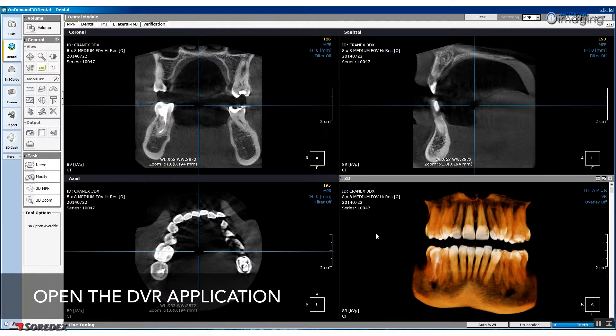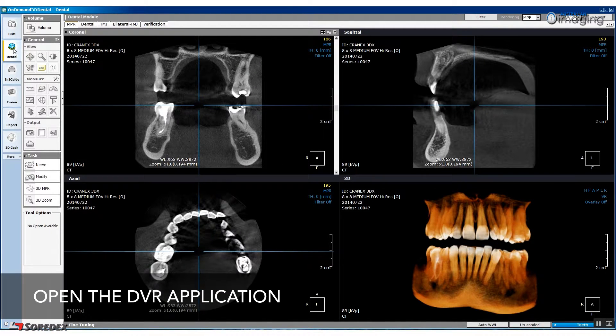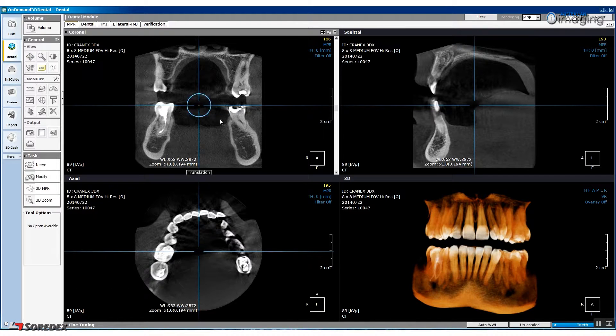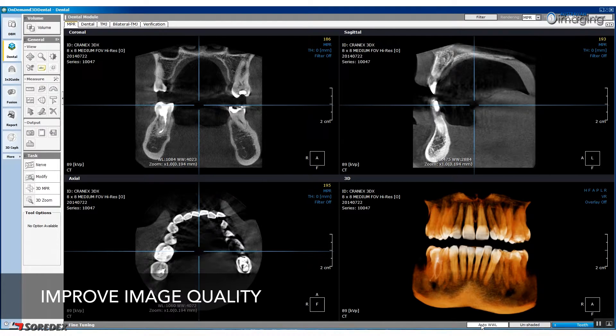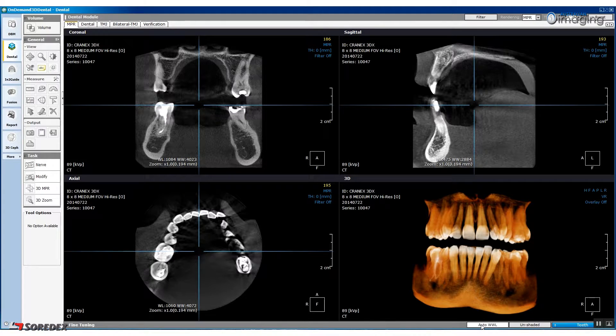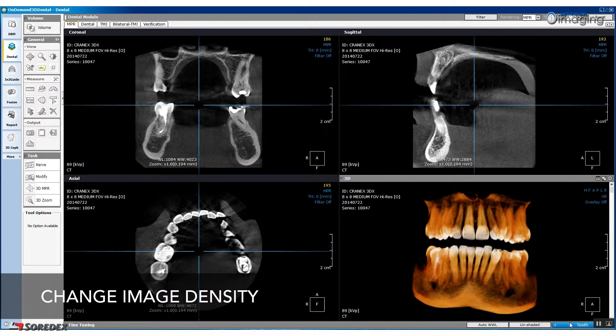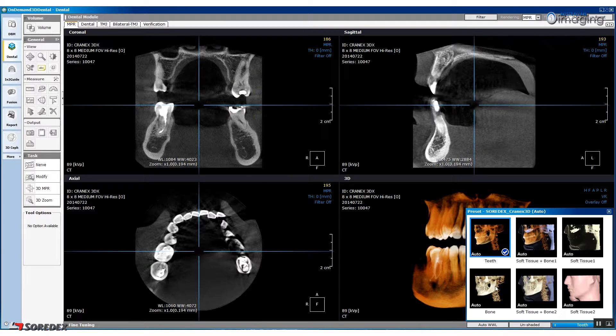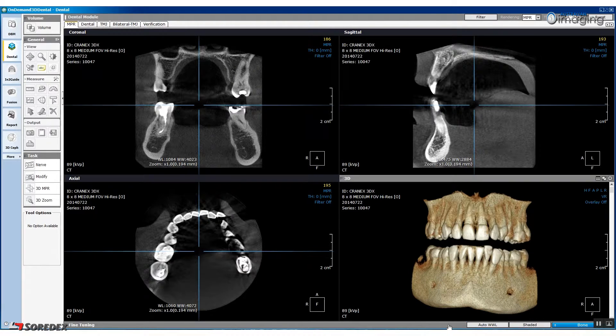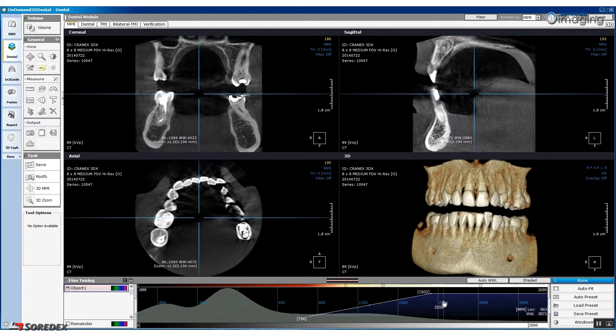To begin analysis, open the Dental Volume Reformat or DVR application. Whenever you are working with a new image, press the Auto WWL button to create the best quality image. To change the density of the 3D rendered image, click the Teeth button and then select the Bone option. Following this, click the grey Fine Tuning bar to bring up your adjustment options.